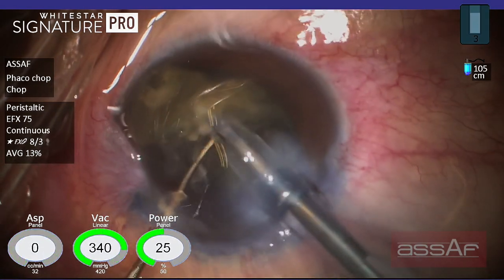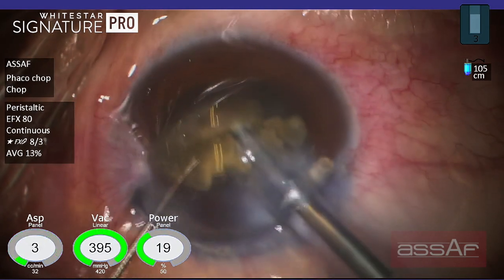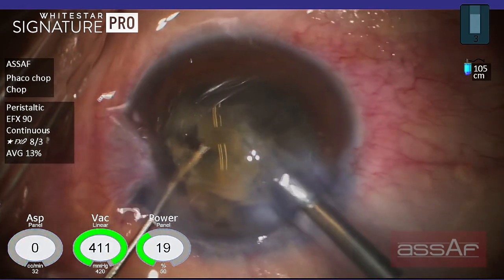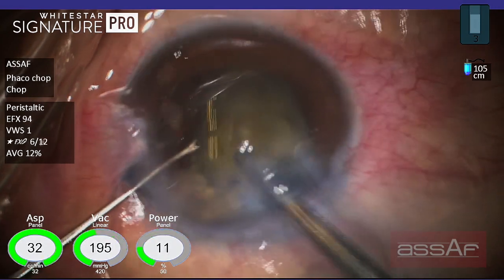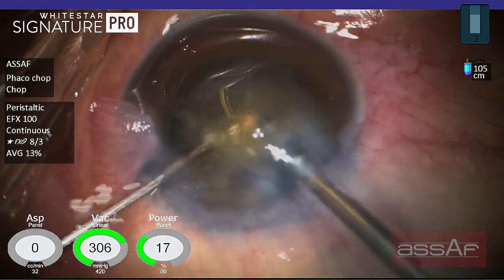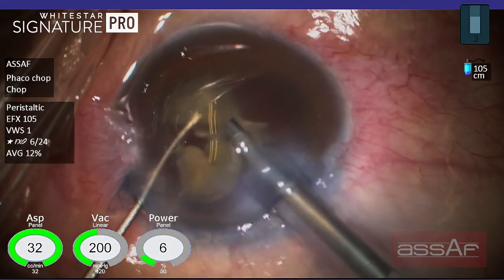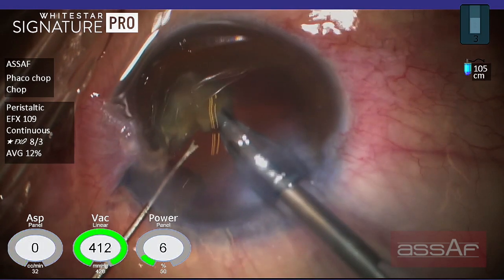Now we have more space and more access to the posterior surface of each quadrant. Trying to elevate this isthmus away from the posterior capsule — ultrasound can disrupt these cortical fibers, or just with the mechanical movement of the second instrument in the left hand we can cut these fibers. We have now a free quadrant within the lens capsule ready for emulsification. Only maybe two quadrants are still interconnected together — it doesn't matter because we now have enough space to deal with these two quadrants together within the lens capsule.